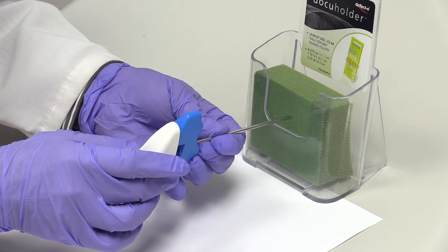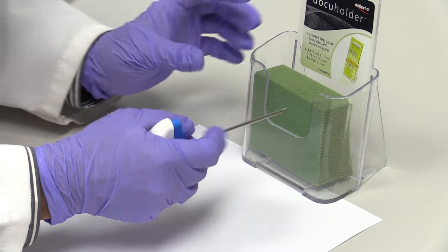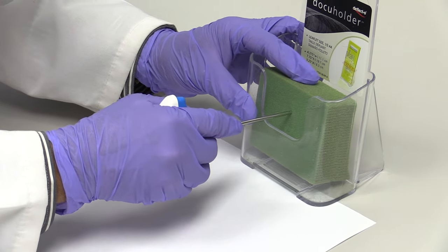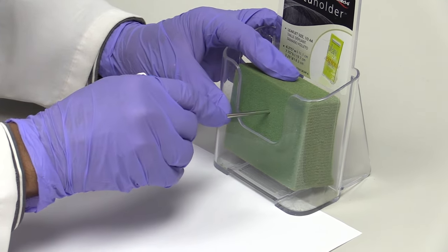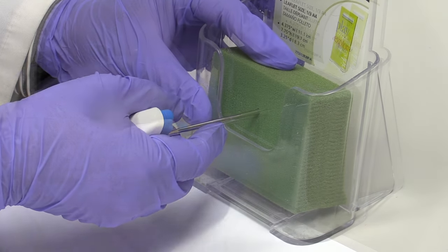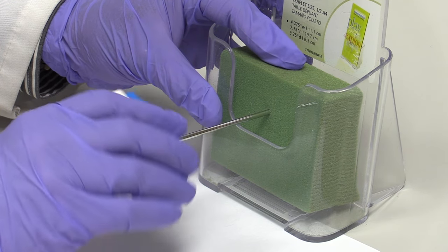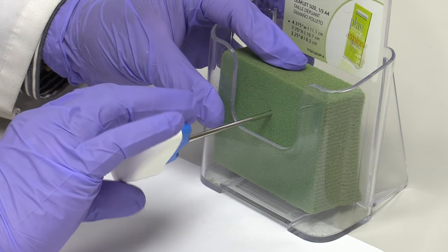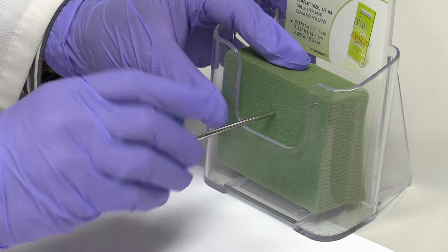Once the trocar is removed, replace the plastic protector cap on the top of the T-bar handle and advance the needle forward with a slow, steady, and controlled clockwise and counterclockwise rotary motion until an adequate depth is reached, about 20 to 25 millimeters. Then, rotate the needle completely several times along its long axis with clockwise or counterclockwise rotary motion to sever all the trabecular connections at the base of the marrow core.